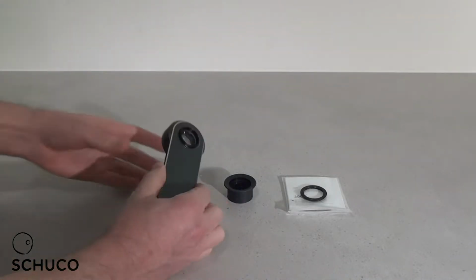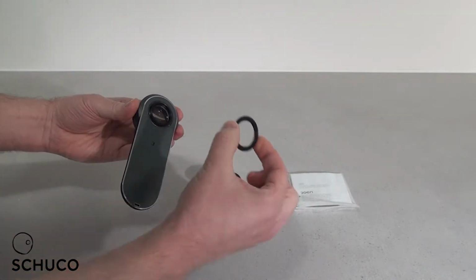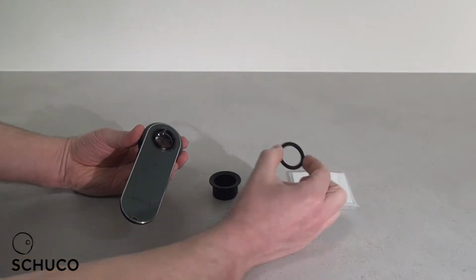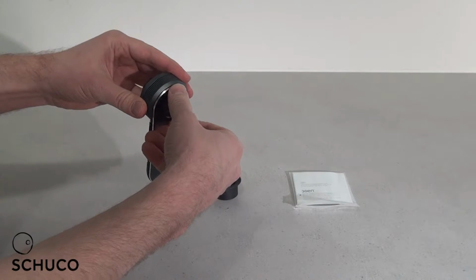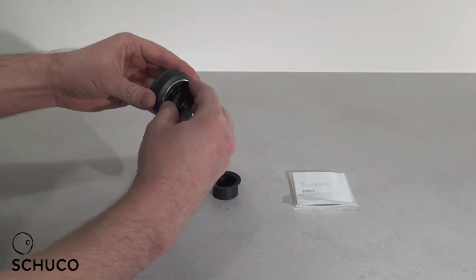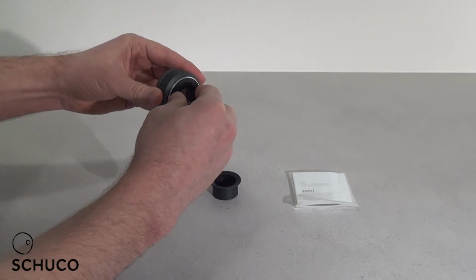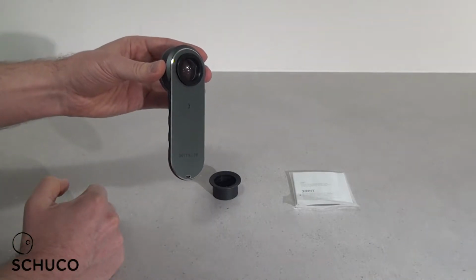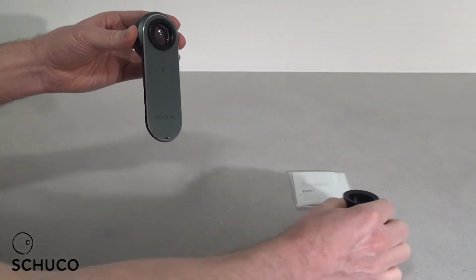So the dermatoscope will come with an eyepiece and a magnetic ring. For the teledermatology project, you only need the magnetic ring. And this is screwed onto the back of the device in a clockwise direction. And this allows the iPod to magnetically attach to the back of the device for taking photos. The eyepiece is not needed for teledermatology.